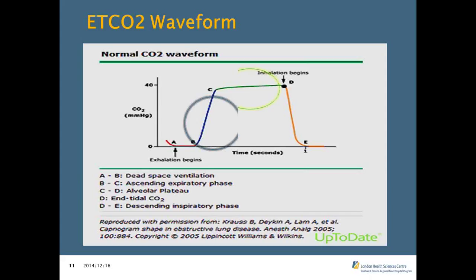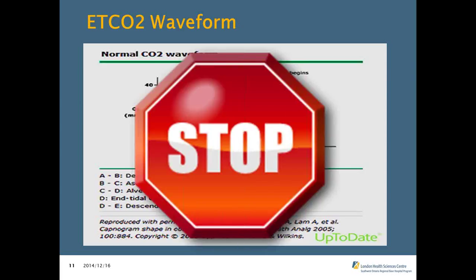Phase 3 is circled in a yellow-green color, and this is the alveolar plateau phase. Notice as you're looking at the circled area, it has a slightly increased slope. It's because this includes late emptying of the alveoli with a lower VQ ratio. It's low because in normal lungs, the lower parts of the lungs are generally better perfused than ventilated and contain higher levels of carbon dioxide.